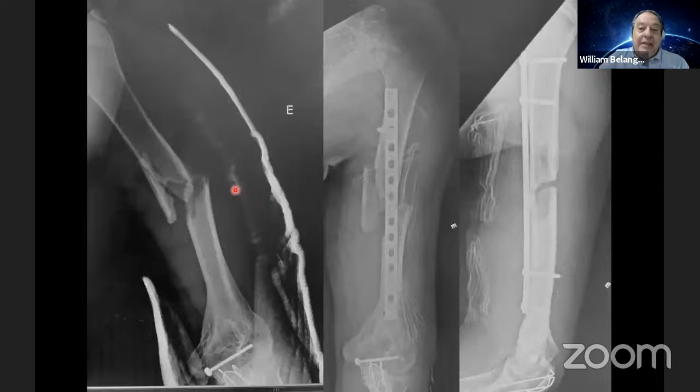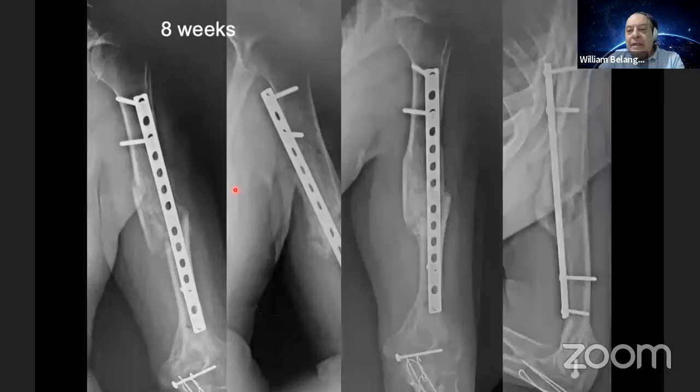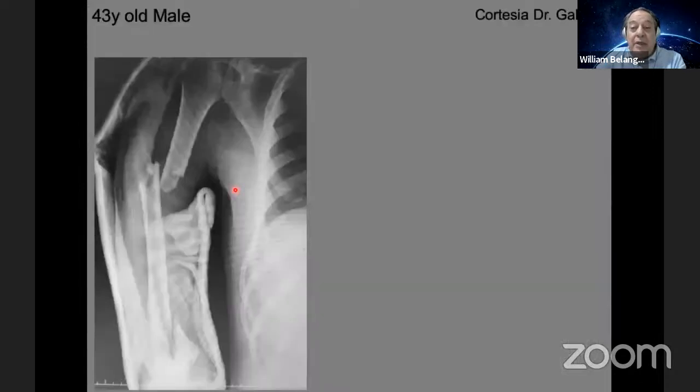This is a case that was treated by this technique. It's a very unstable fracture, you see. It's a short proximal fragment, okay. Callus after 8 weeks, very good. But during the follow-up of the patient, you see here, fatigue of this screw. And this caught my attention.